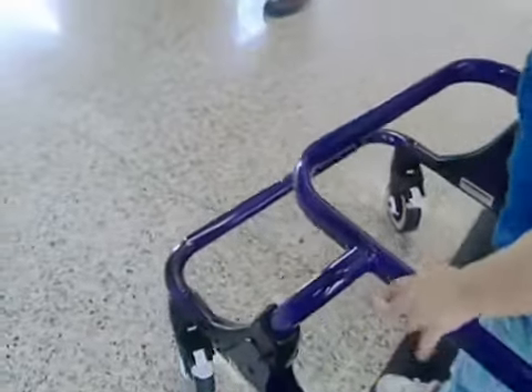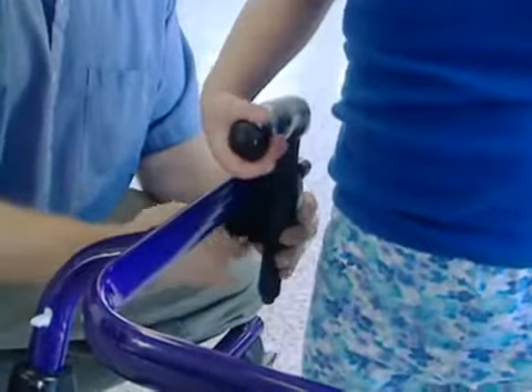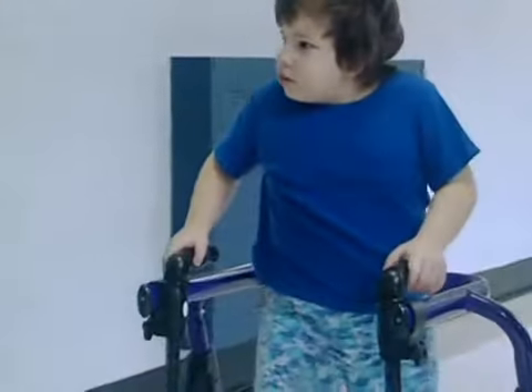Joan has progressed to the point where she only needs the frame to support her. Handholds can be used to provide a better grip. With nothing in front of her, Joan is free to move.